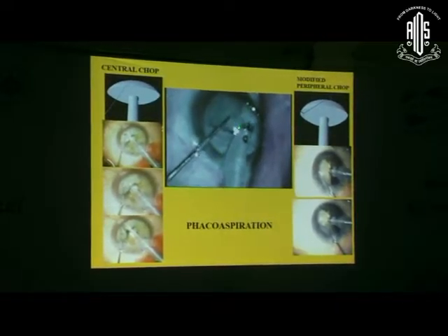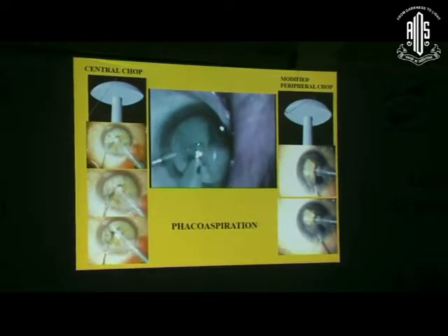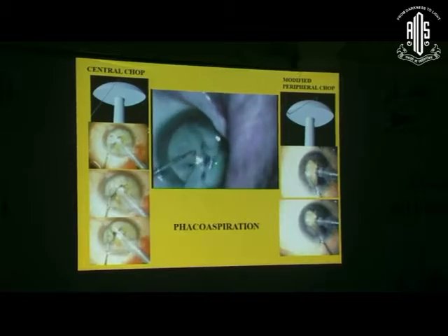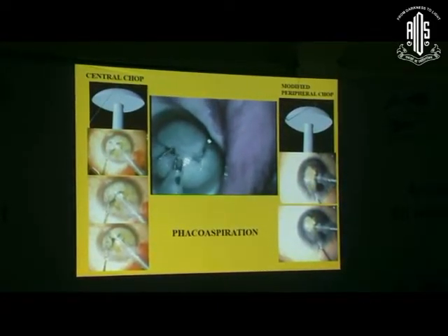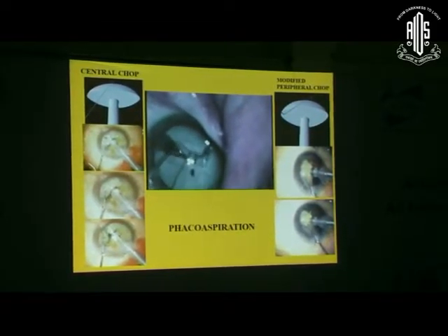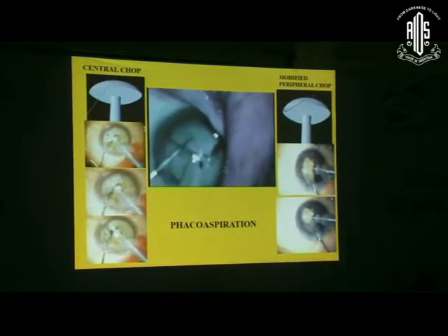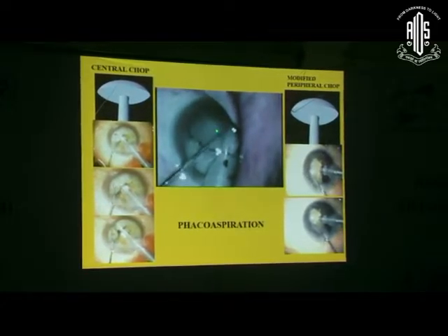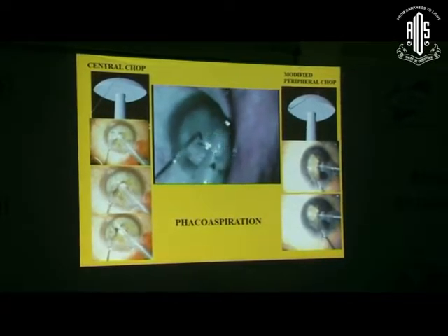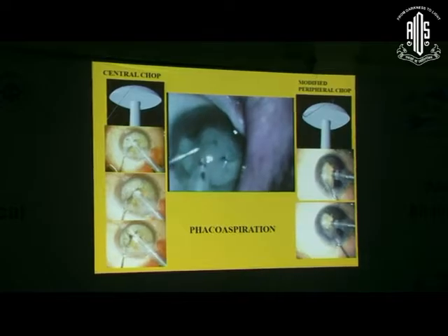This is a central chop where you are putting the chopper into the nucleus. I have created a vacuum seal, and the chopper is just close to the tip. It should not cross the tip on this side or you will lose the vacuum seal; if it is too far away it will tumble. So it has to be adjacent - just adjacent to the tip in front of it, bury it, and then separate sideways. Now the vacuum seal has been created - it holds there like a lollipop. You can see the chopper getting buried, and once it comes close I am separating it. Reposition your chopper where you want to split the fibers - don't keep pulling from the periphery. Always go closer to the fibers you want to split, to avoid stress on the zonules.